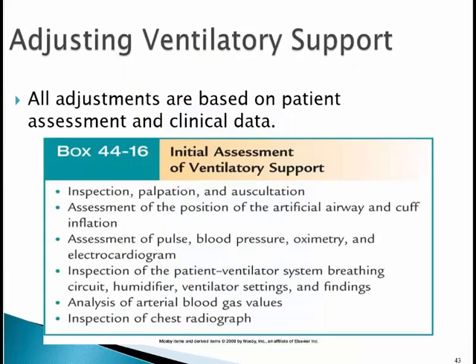So we have the ventilator set up and it's ready to go. And now we're going to attach the patient to the ventilator, and we're going to turn our focus to the patient. Now there may be no connection here. It may be that you're in the ER and the EMS brings the patient in and you attach them to the ventilator there. Once that patient's on your table, it's your patient. Then you need to do the assessment stuff.